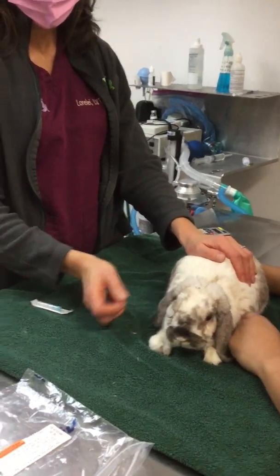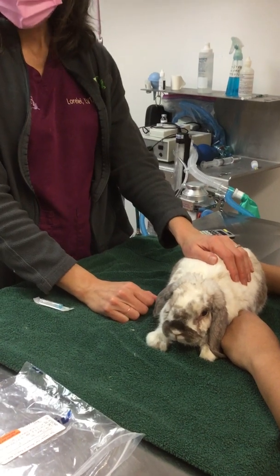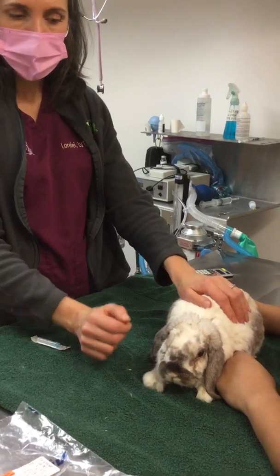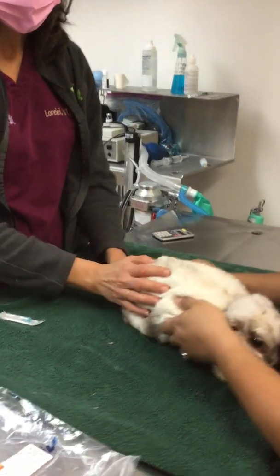Today we're going to demonstrate how to give a subcutaneous injection to a rabbit. Specifically, we're going to be doing a penicillin injection, which is not safe to give rabbits by mouth, but it is safe to give them by injection. So I'm going to demonstrate that today.